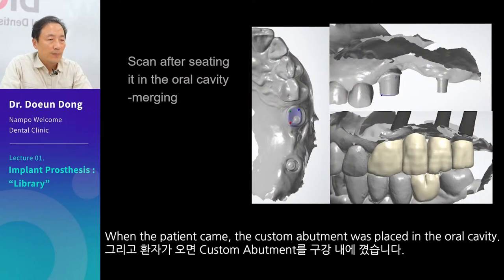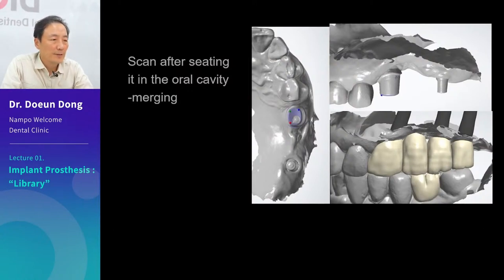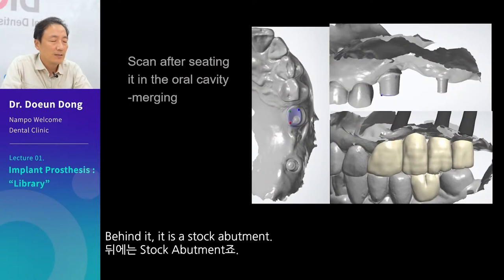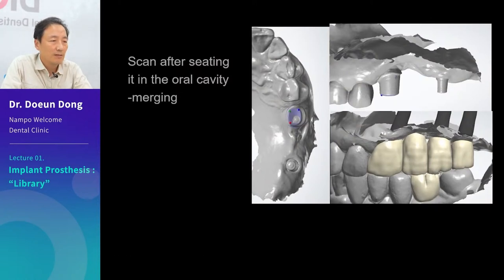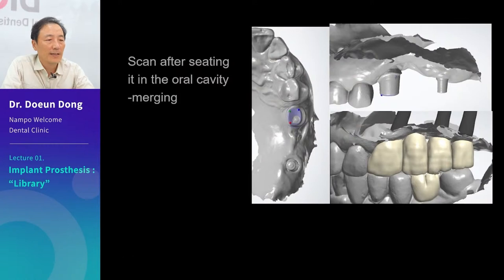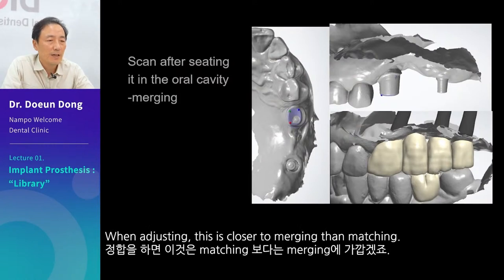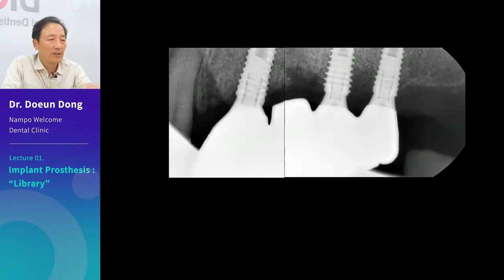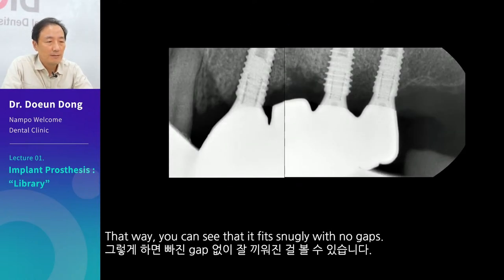When the patient came, the custom abutment was placed in the oral cavity. Behind it is a stock abutment. It can just be scanned while worn. When adjusting, this is closer to merging than matching. That way you can see that it fits snugly with no gaps.